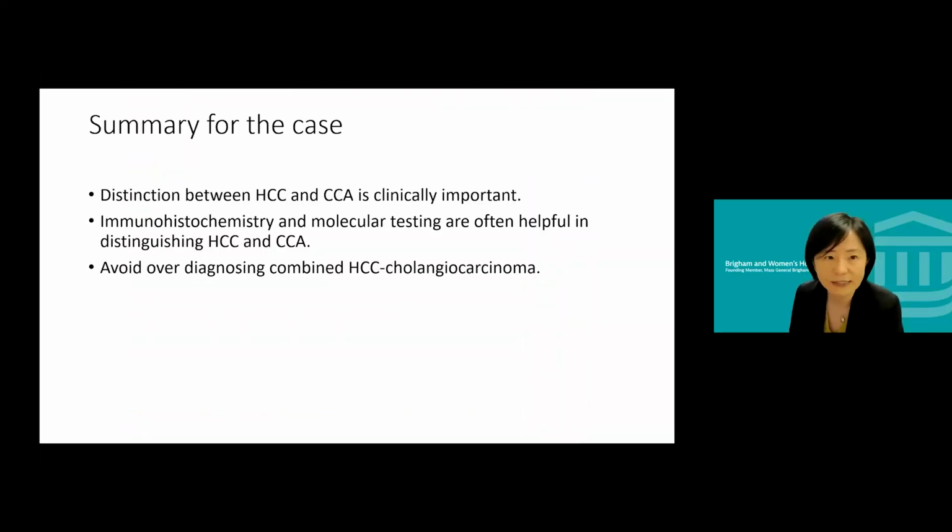So hopefully in this case, we discussed how to differentiate HCC and cholangiocarcinoma, the immunohistochemistry and genetic findings that could be helpful, and also tried to avoid overdiagnosing combined HCC and cholangiocarcinoma. So that really concludes this session.